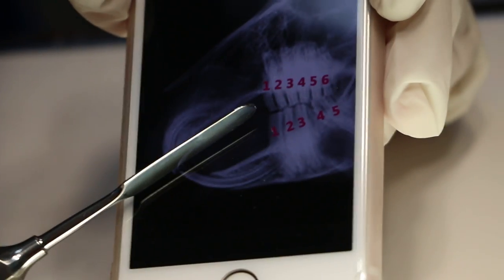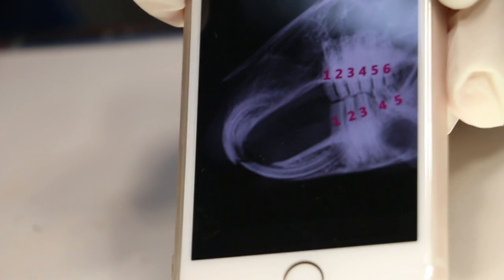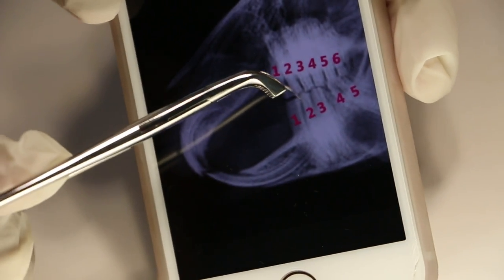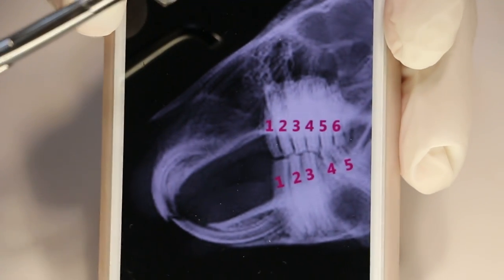Number two is a spatula used to press down the tongue if needed, or press the cheek on the side to open up. Number three is the tooth extractor — after using the luxator, or if the tooth is already loose, you hold it with the forceps, loosen it some more, and then extract it out.